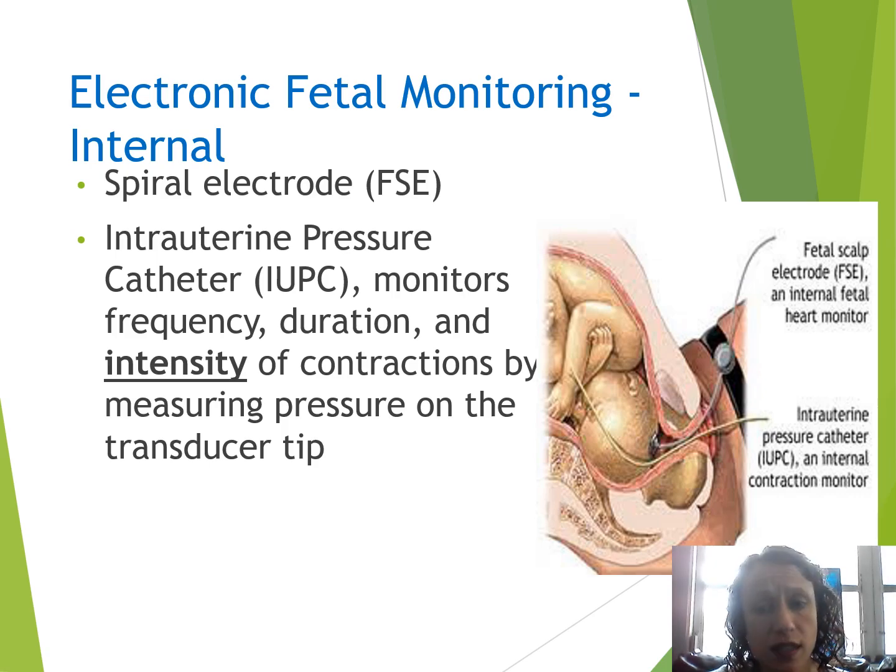Again, it is invasive. Their water has to be broken. There are risks with the IUPC, and just about any time that we're introducing something from an outside environment to the inside, we're increasing her risk for infection.